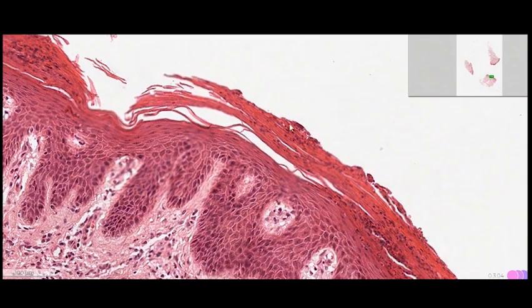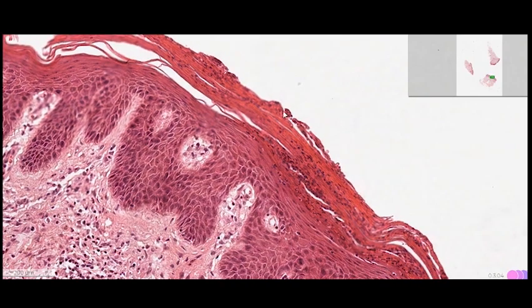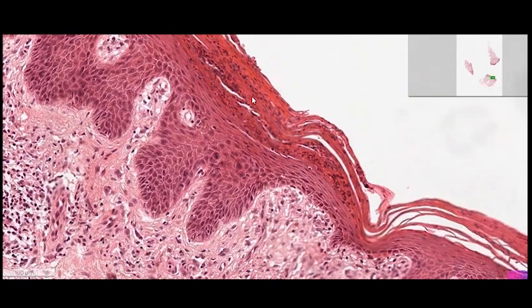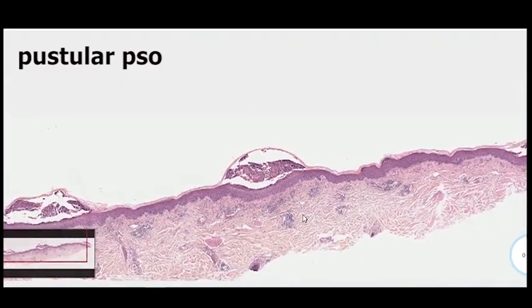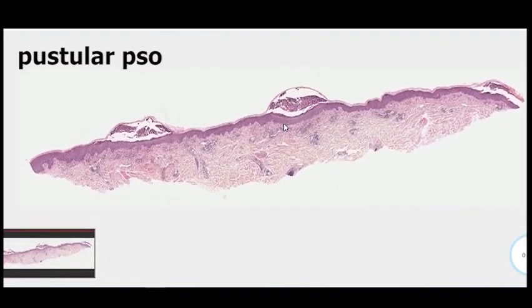Again, we have neutrophils on top of the stratum corneum, then we have parakeratosis, so it's good for psoriasis. Again, neutrophils in the corneum, parakeratosis, neutrophils in the corneum, then parakeratosis. This nice layering goes with psoriasis. Again, the dilated tortuous blood capillaries with mixed superficial perivascular inflammatory infiltrate all point to psoriasis. After psoriasis, clinically you can see pustules. There are pustules in the patient, and this can be reflected on the histopathology also. You can find this nice subcorneal pustule.